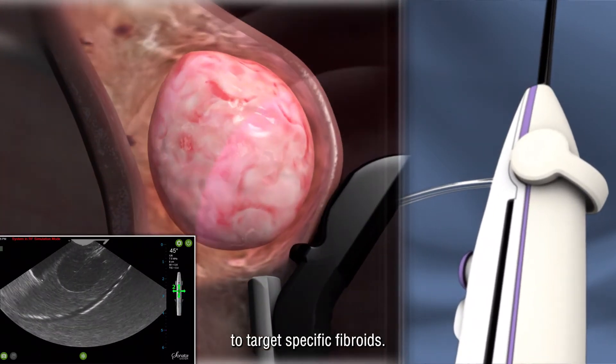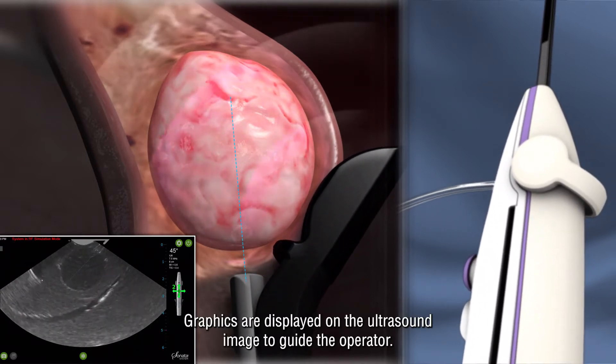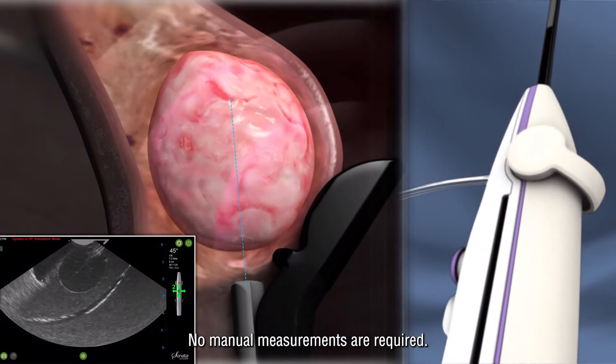The physician uses the intrauterine ultrasound probe to target specific fibroids. Graphics are displayed on the ultrasound image to guide the operator. No manual measurements are required.